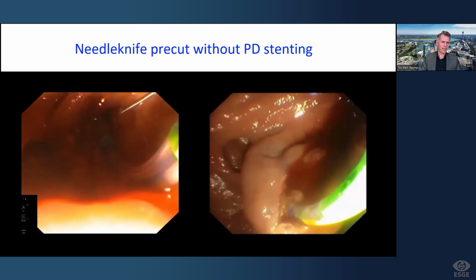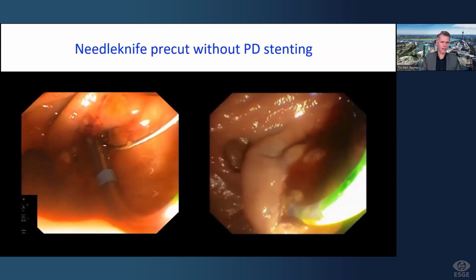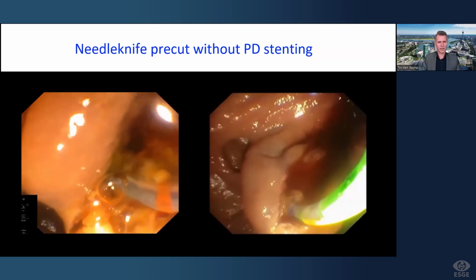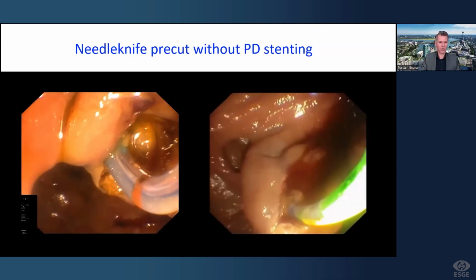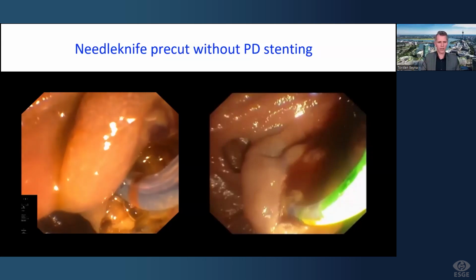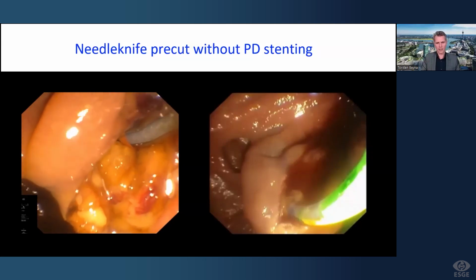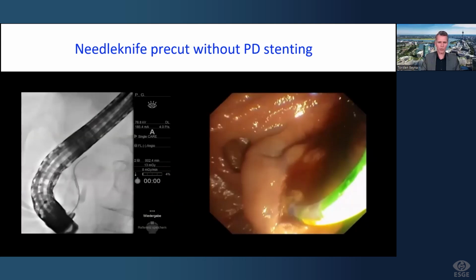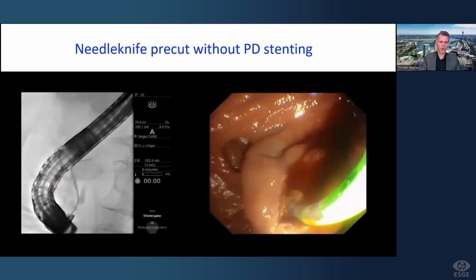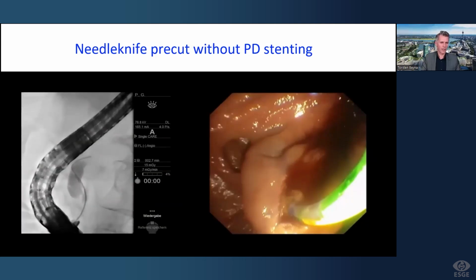So after that, as you can see now, it looks much nicer after precut and putting a wire into the pancreas that straightens, as Gavin mentioned before, it straightens the papilla, brings it out of the diverticulum, makes life easy. And here on the right-hand side, of course, if you have this large protruding papilla, then you can just go straight forward with the needle knife. So this was just my short presentation about precut. So maybe there will be some additional questions.